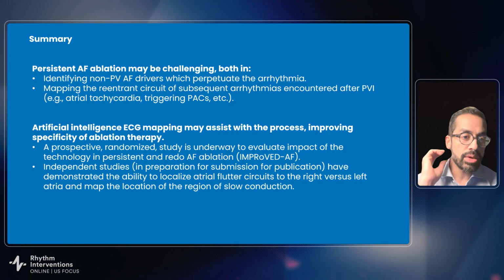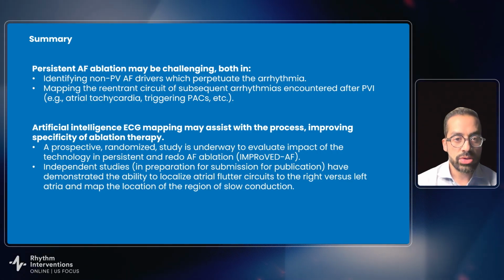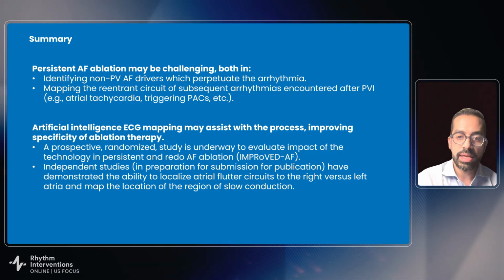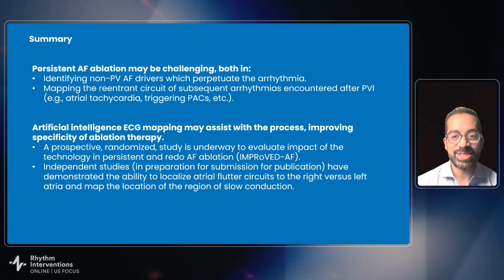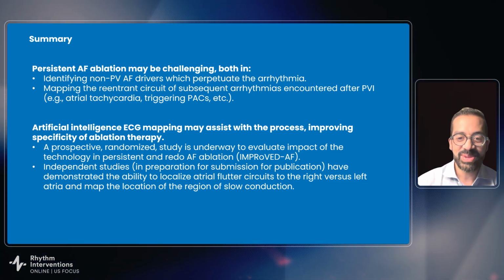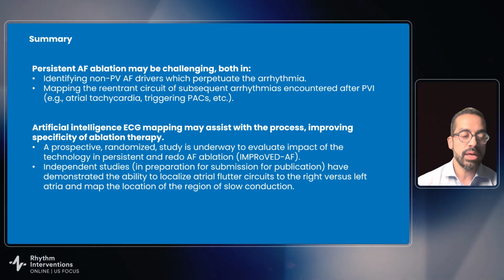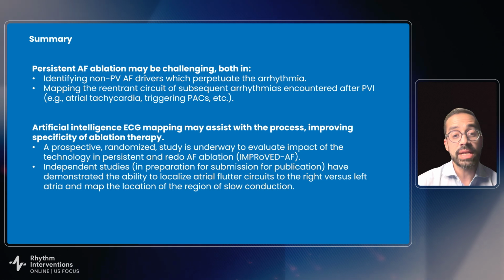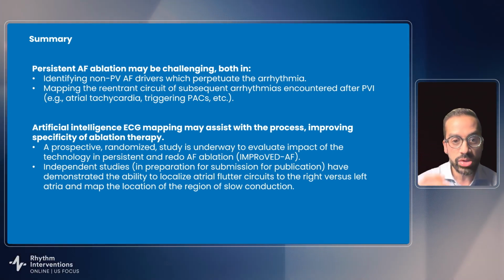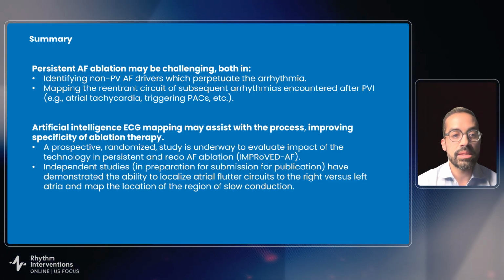So for me, the key takeaways are that when we use VMAP, we're going to be able to extend our lesion set, not in an indiscriminate way. And I recognize that the map I show, and Dr. Tomassoni will comment on this, I'm sure, is one that's relatively anatomic ablation out of the box, PVI, posterior wall, but certainly one that pushes us to take care of how extensive or how reduced our lesion set should be when we have the additional information through the vector analysis.